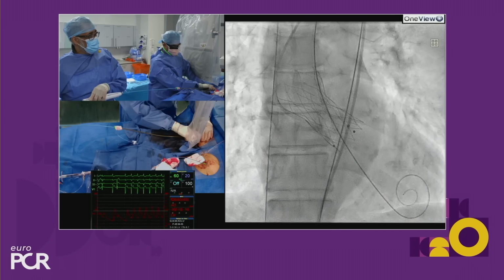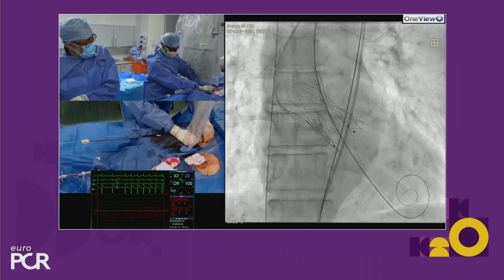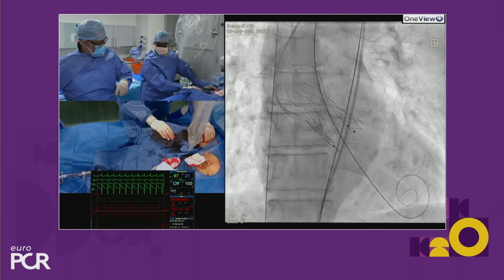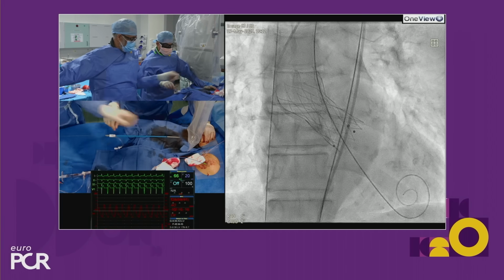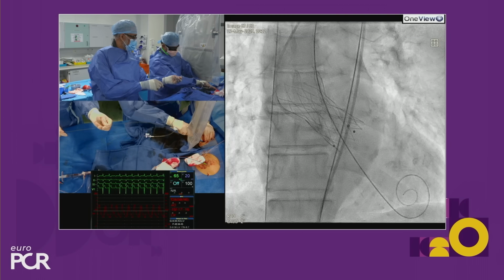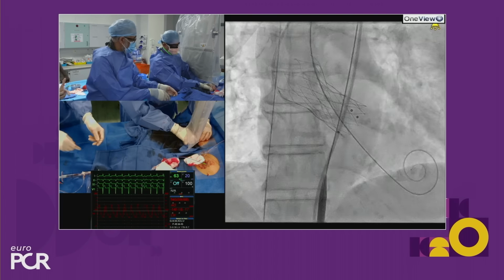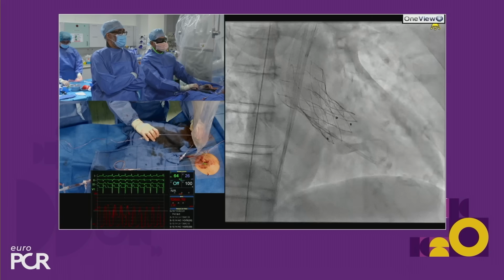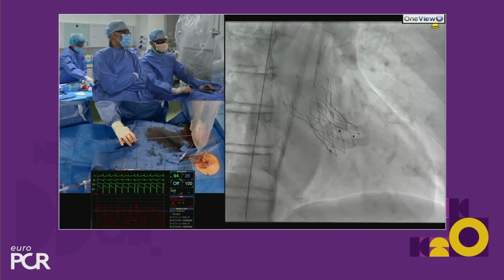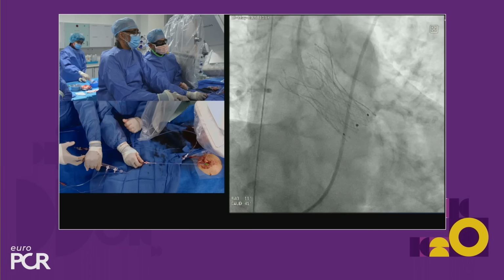We've got a couple of pictures to do and some hemodynamics to do. But the case has gone actually very well. We've done sheathless because we don't want to enlarge a hole. We didn't need to enlarge the hole. And you can see that obviously slips in perfectly easily given the valve's been through there. Big flush syringe, please. Yeah. Do a pullback then, yeah? Yeah, do a pullback. And again, I screen this all the way out. Ready?